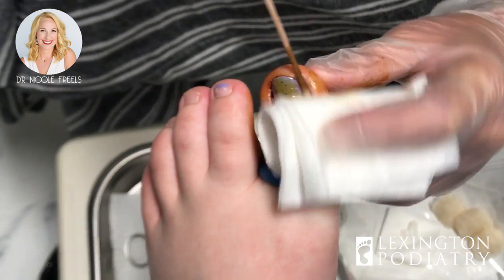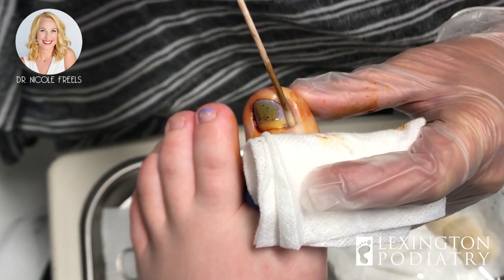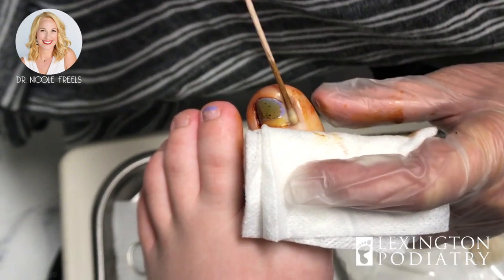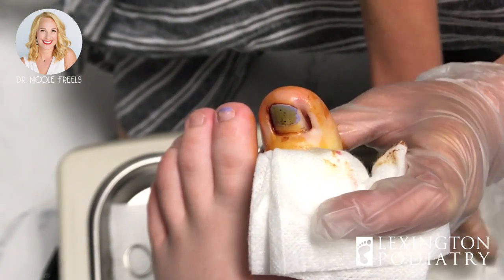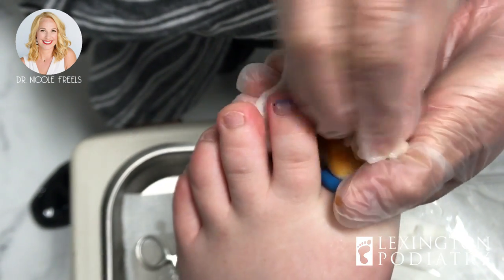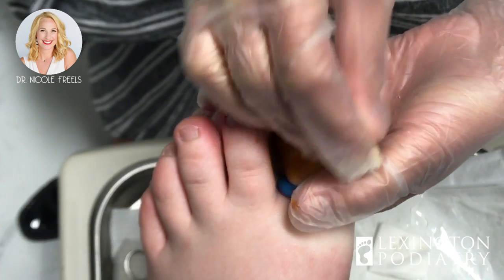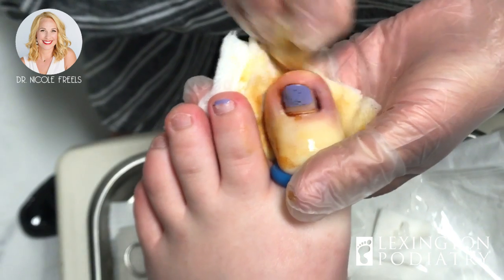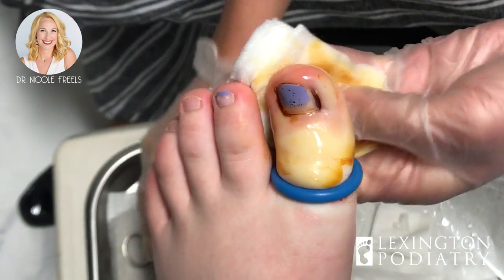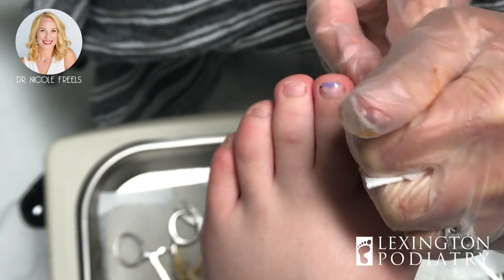You're gonna go home and kick this up in the air and be a couch potato for me, right? Any questions about how to do your bandage changes tomorrow until you come back? Let's get it cooled off — this will take away any burn you feel. There we go. Feel better? Okay, plus having this tourniquet on — we'll take that off. You're done, I just need to wrap it up.